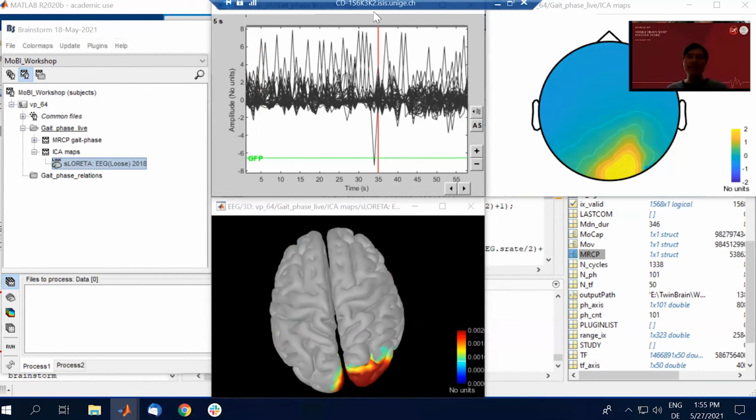How to use that in Gait is a bit more complicated because in frequency analysis, you have to image the real and imaginary part of your FFT results separately and then compute the magnitude in the source space. That's why I'm focusing on these linear relationships because they're easier to visualize. But for now, this is exactly the principle.